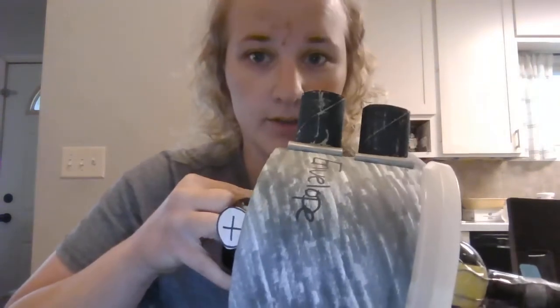In order to produce X-rays, it requires a source of electrons, a target material, high voltage, and a vacuum, and that is what the X-ray tube is for. So we're going to start our tour here at the envelope. Everything except for the stator is confined within this, is considered to be the tube, and that includes a cathode and anode. It must be sealed tightly on the cathode and anode assemblies to maintain a high vacuum. Where the X-rays exit the envelope is called the window.